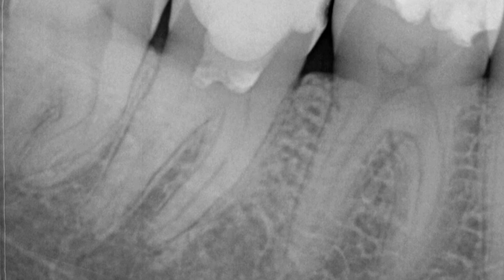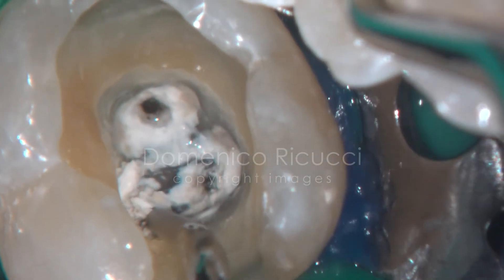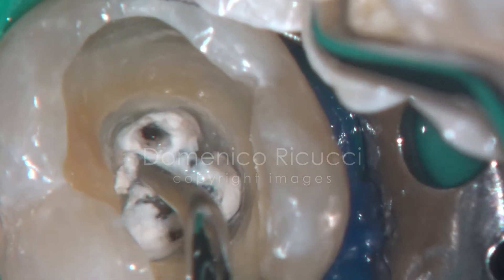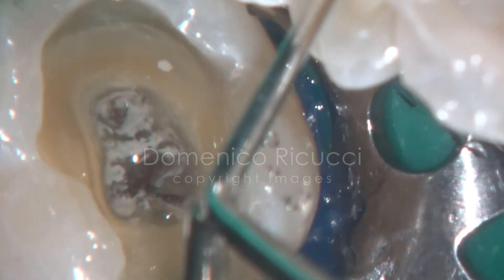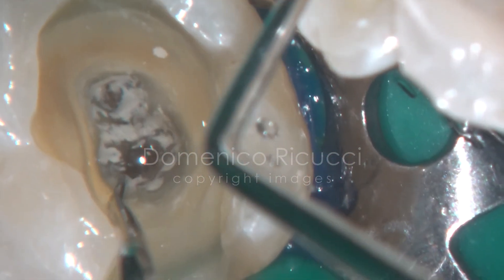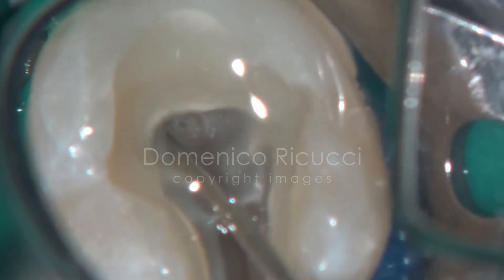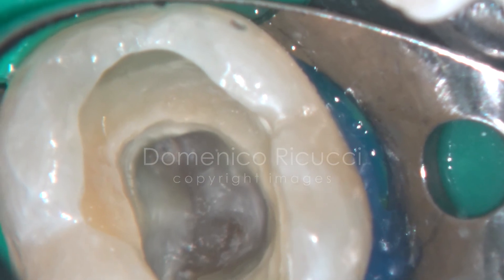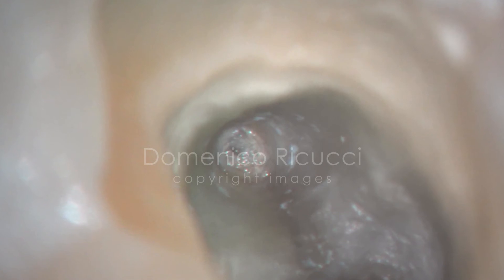The pulp responds weakly to a cold stimulus applied in the cervical region. After anesthesia and isolation, the restorative materials are removed together with the bioceramic material. A mineralized tissue is revealed filling the area of the previous surgical wound.